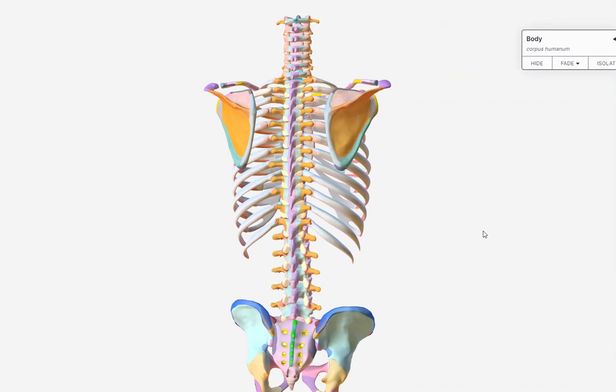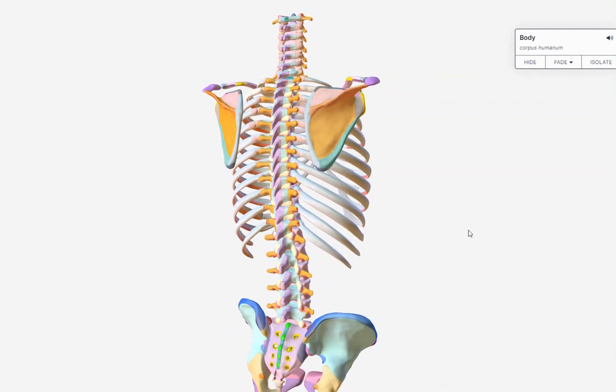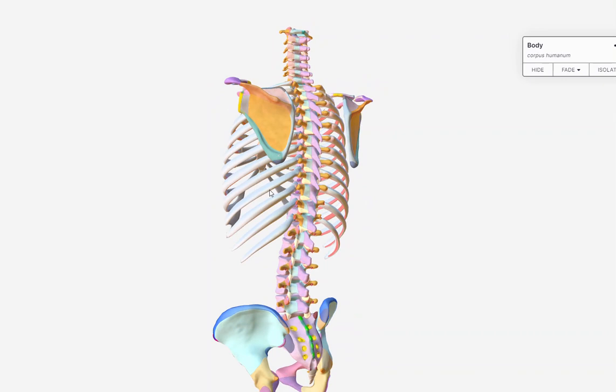We're going to rotate the patient so that their left side goes toward the whiteboard, toward our imaginary upright bucky, or toward our imaginary table. Left anterior oblique. The patient's right side is rotating up away from our imaginary bucky or table, okay? So left anterior oblique. Notice the central ray will still be entering the patient's back. So both an LAO, left anterior oblique, and RAO, right anterior oblique, are PA projection.